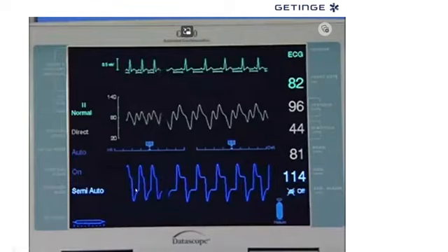Also notice that in tachycardia, you're still getting the same height of gas waveform. So you're still inflating the balloon appropriately to 50 milliliters typically. Most balloon pumps are 50 milliliter, or 40 milliliter in shorter patients, less than 5'4". So you're still inflating it to 50 milliliters, but you're not getting enough augmentation for that 50 milliliters because there is not enough diastolic time for diastolic augmentation of pressure to continue to rise.